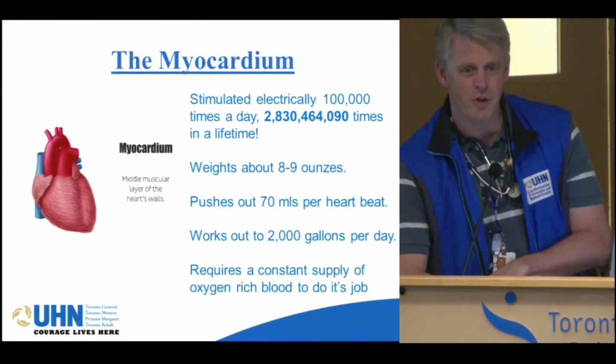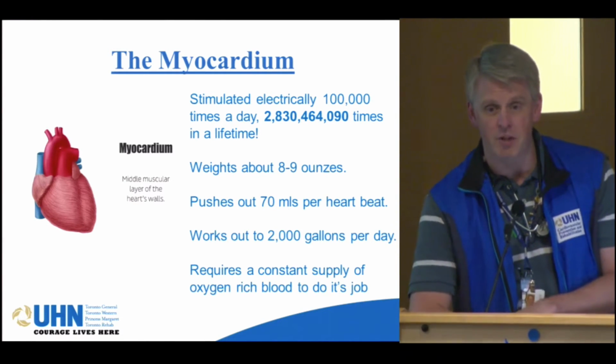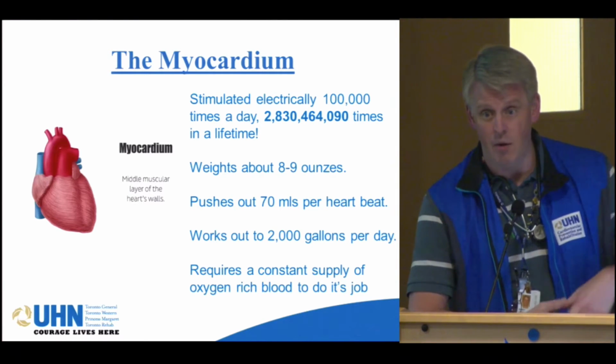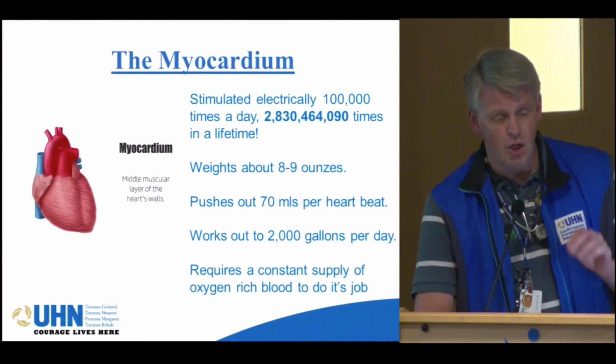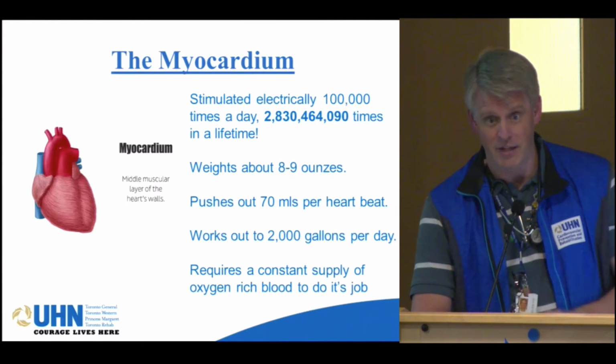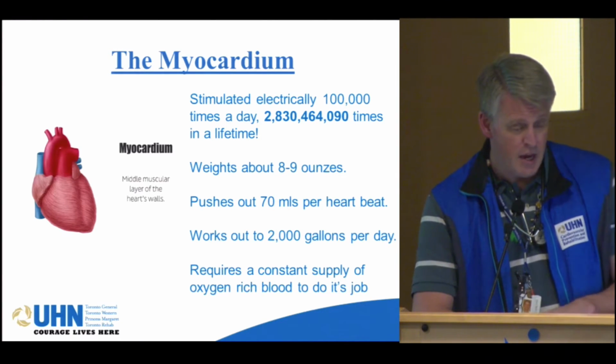Okay, so the Holter monitor is also kind of cool, and it's something for you guys to keep in mind. If you're ever having symptoms and the doctor sends you for a test, an ECG, and while you're having the ECG, you feel great. You really want to be monitored while you have the symptom. Okay, that's very important. So it's good to know that things like Holter monitors exist.